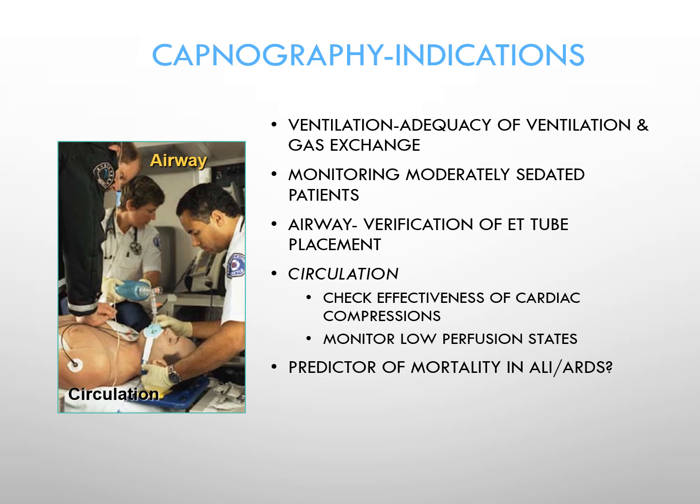Some of the indications we'll focus on are, for example, monitoring ventilation or the adequacy of ventilation and gas exchange, such as that may occur in a mechanically intubated patient who perhaps is weaning on pressure support, or a spontaneous breathing patient who may have received some sedation to accommodate a procedure, or may have a progressive neuromuscular disorder resulting in weakness in the respiratory muscles and the associated buildup of CO2 because the minute ventilation is dropping.